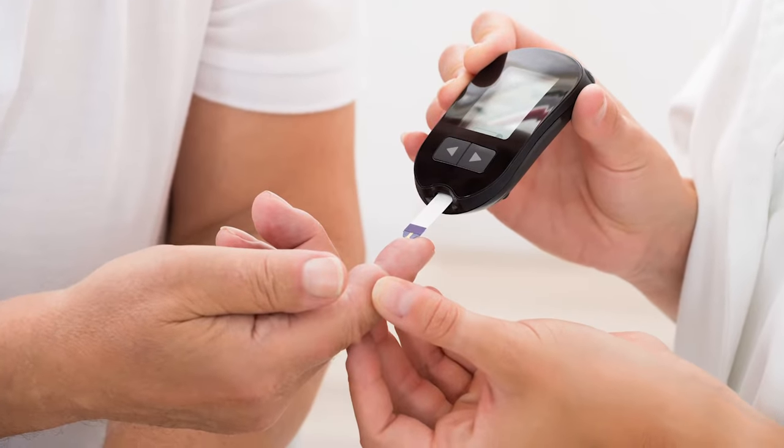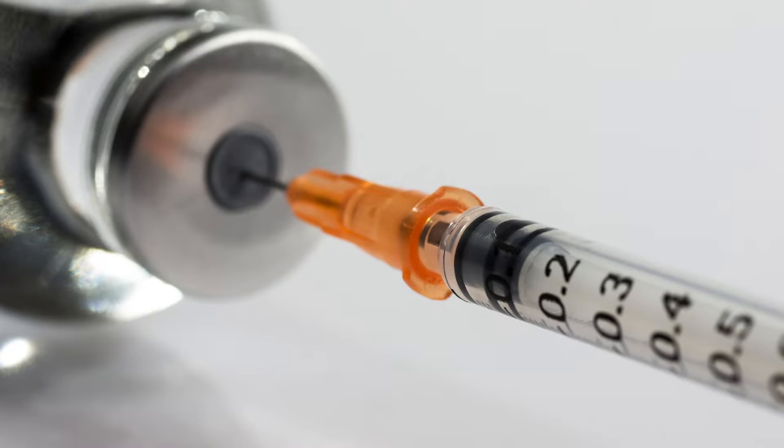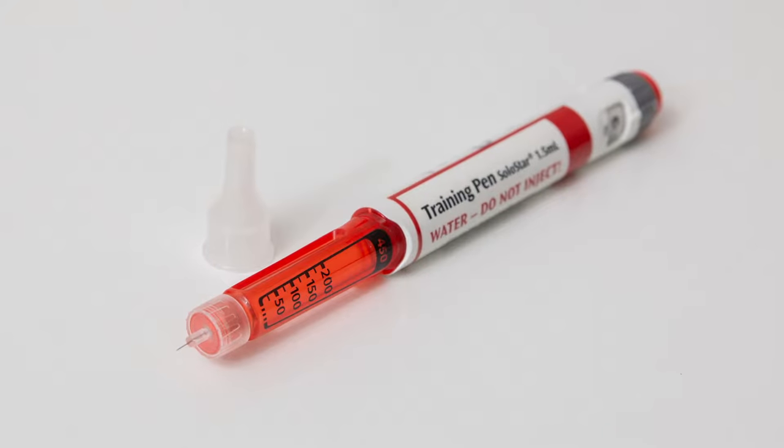Insulin is a medication that is prescribed for people with diabetes. You may be prescribed insulin in a vial and you will use a syringe to inject it. It also may be prescribed as a pen and you will use a pen needle to inject it.